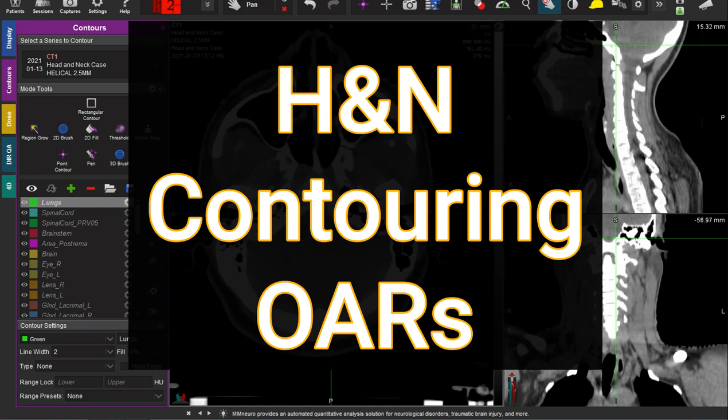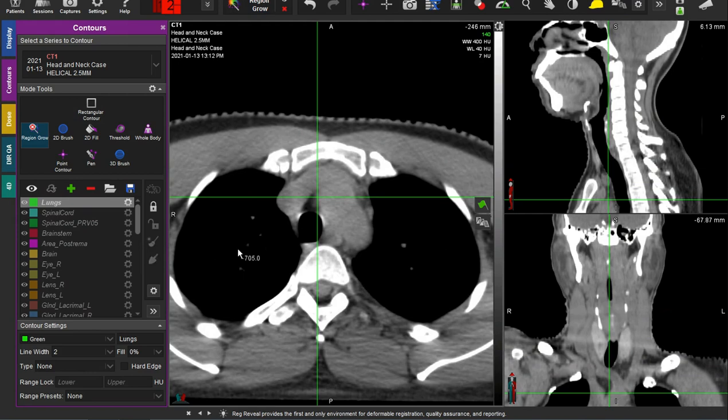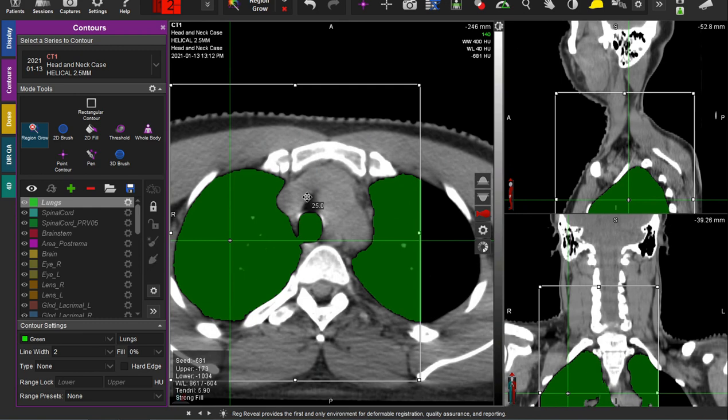What's up YouTube? Today we are going to show how to contour all of the head and neck OARs in less than 10 minutes. This is an ambitious feat, but let's get started. It's always intimidating when you have a head and neck case come in, so sometimes it's nicer to start with the simple.